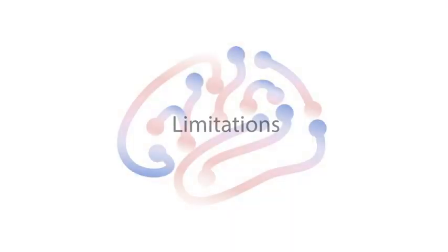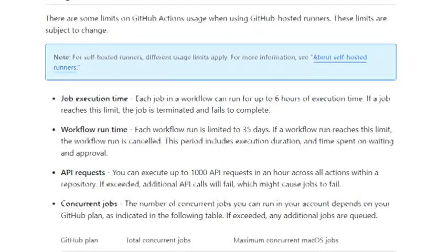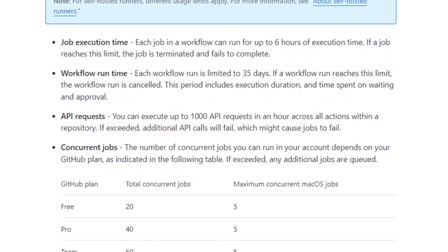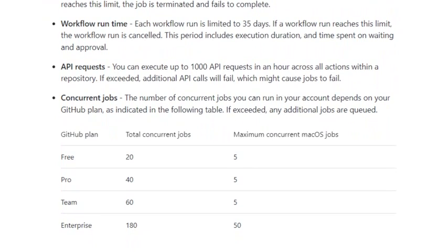There are some limitations. The free resource on GitHub has restrictions on the cloud storage. Currently, DSI Studio Cloud is only good for small to mid-sized projects that have less than 200 scans.